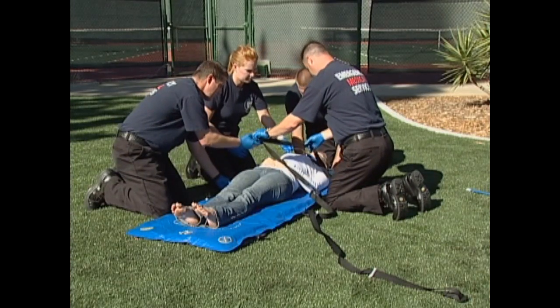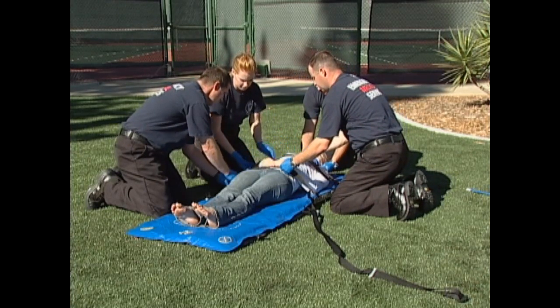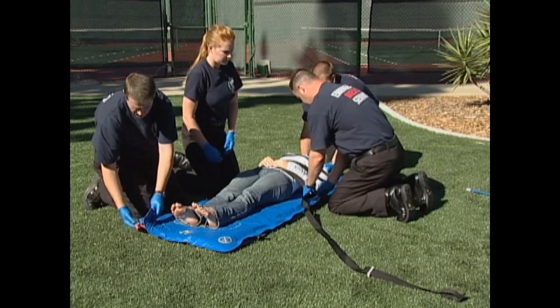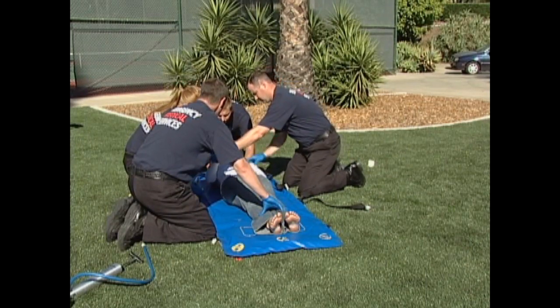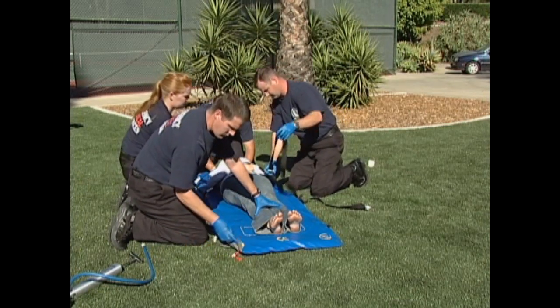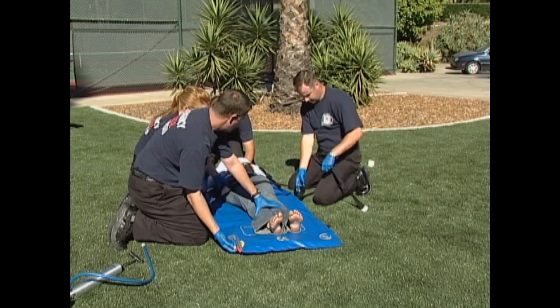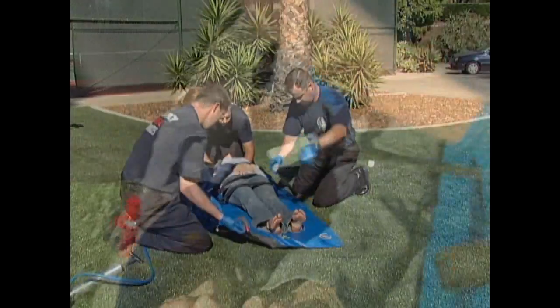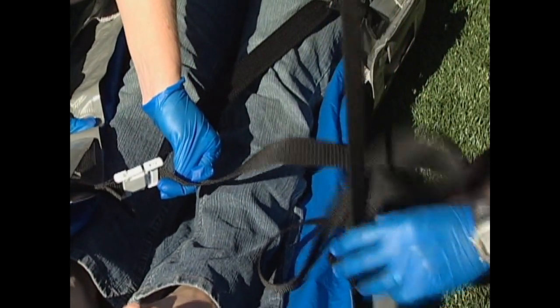Attach the patient restraint strap. Keep in mind that one of the primary functions of the strap is to bring the sides of the mattress up around the patient's body. Here is method number one we recommend: start at the chest with the first buckle and work towards the feet. In a zigzag pattern, attach the black buckles and the white buckles in an alternating fashion. Finish by attaching the black buckle at the foot end.